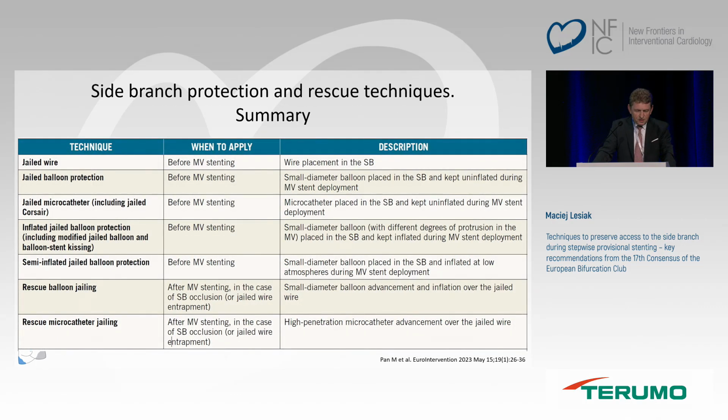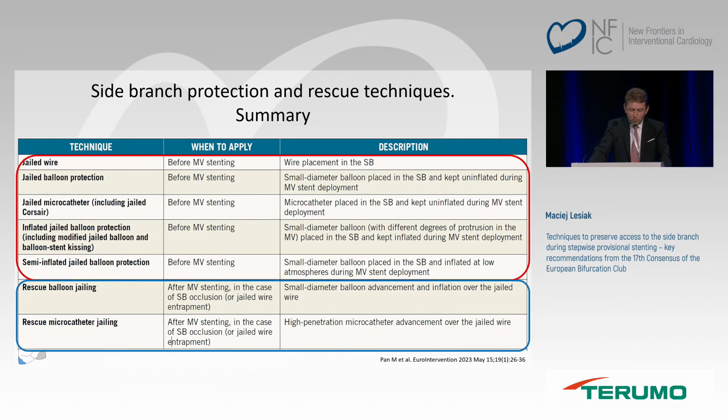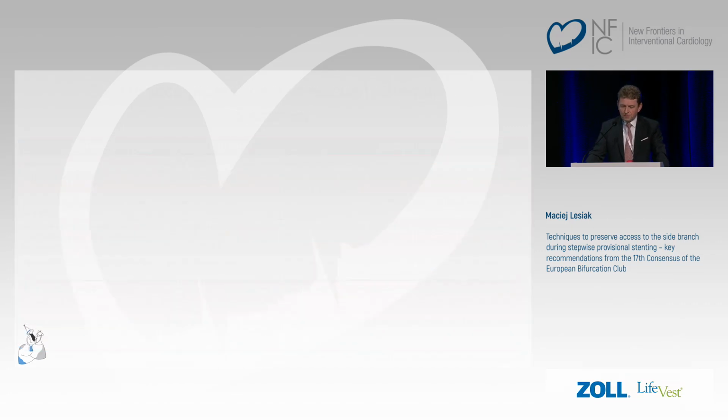So having said this, I will just refer you, due to the time, to this document. You will find a lot of very practical data, what to do before main vessel stenting and how to rescue the side branch after main vessel stenting if you lose it. Thank you very much for your attention.